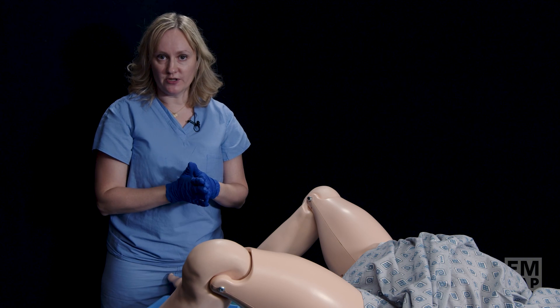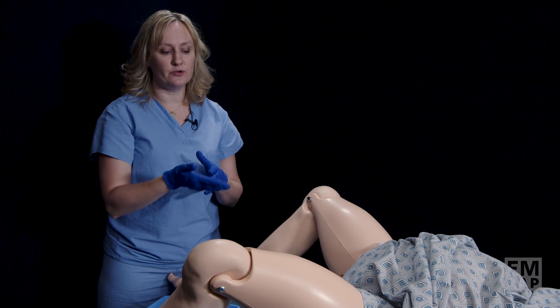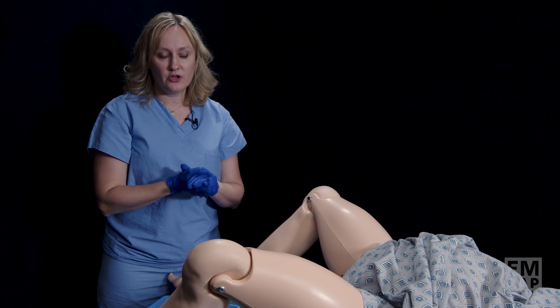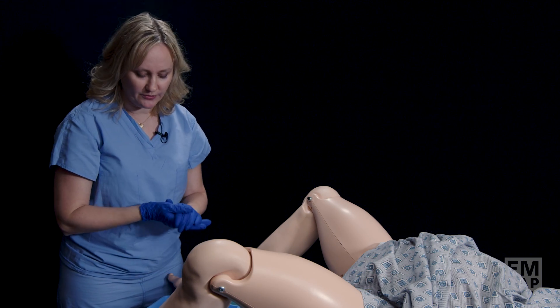In the management of postpartum hemorrhage, if you've gone through your medication algorithm and you're still facing a woman who is hemorrhaging and showing signs of hemodynamic instability, you need to consider placing a uterine tamponade device, such as a Bakri balloon.